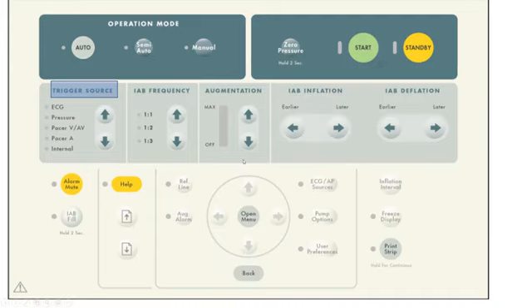So the response to the changes in cardiac cycle in somebody with irregular rhythm is more delayed if you use the arterial waveform, and the balloon may remain inflated between cardiac cycles. So you typically should not use it. You use the pressure for timing adjustment, and the machine does that, and you can do that, as I explained, but you don't use it to trigger.